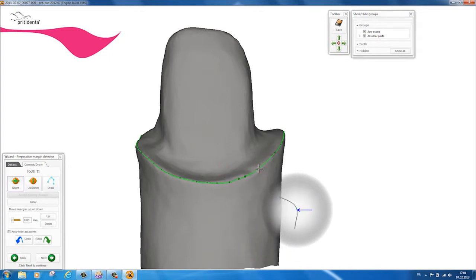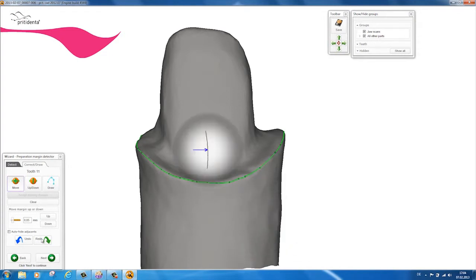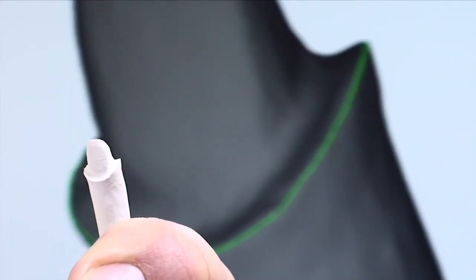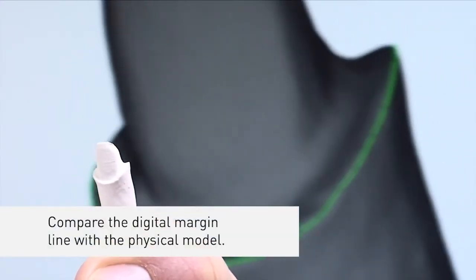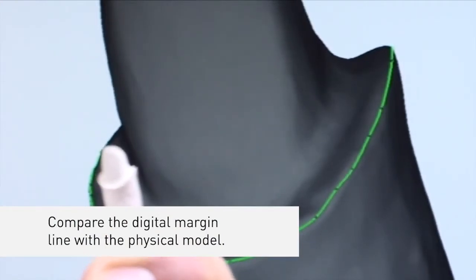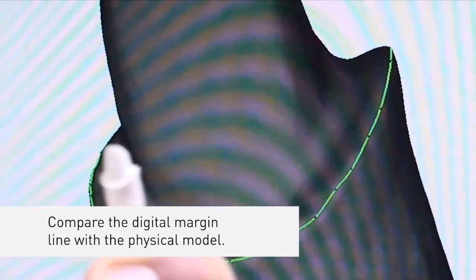If you prefer, you can define the margin line yourself. As a precautionary measure, it is advisable to compare the CAD margin line with the physical model.